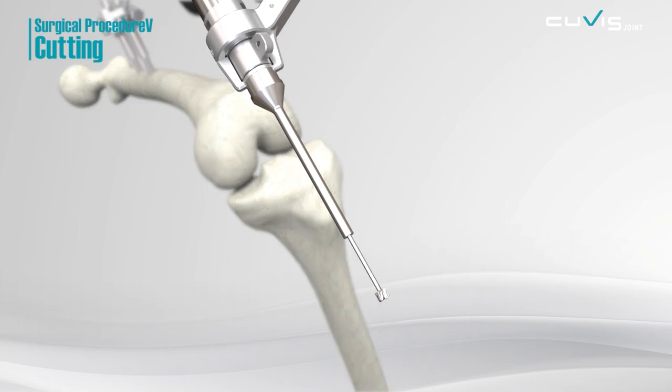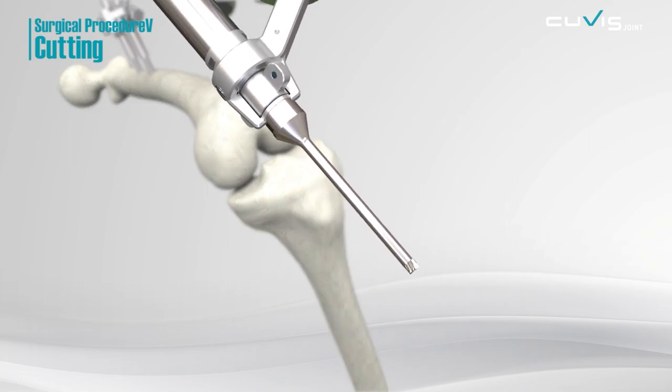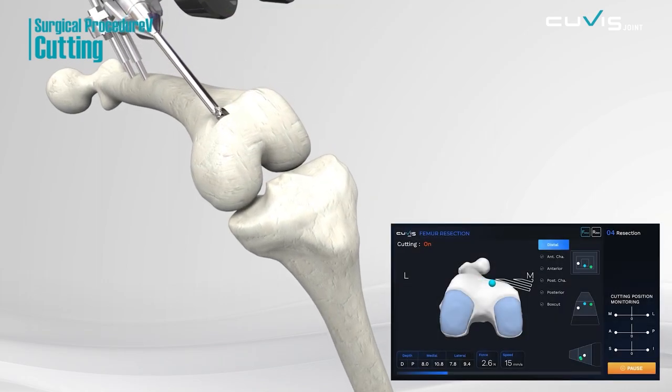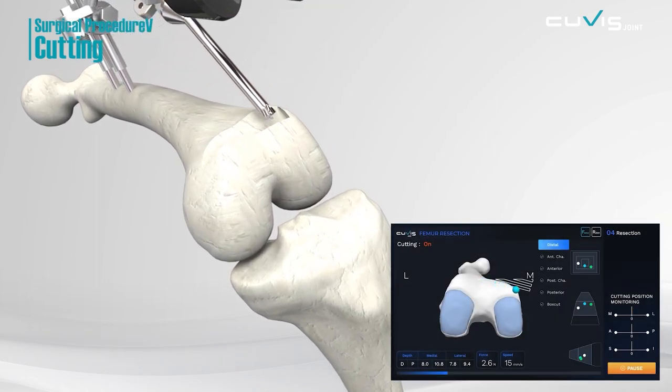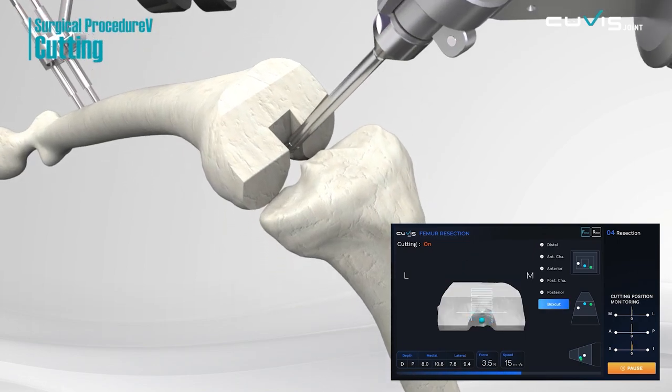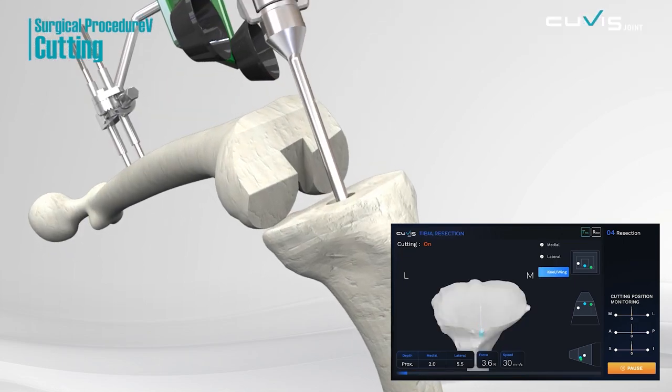Once the surgical plan is confirmed, the cutter moves freely within safe guidelines. The robot performs the milling and, if the cutter is out of the boundary, the robotic arm automatically stops. It also can perform bone resection while modifying the surgery plan.